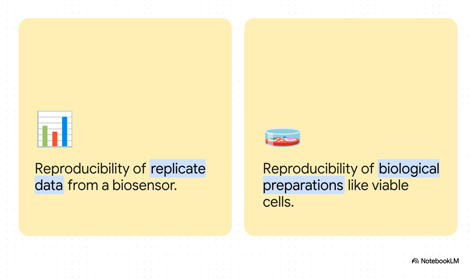You see, reproducibility is actually a two-part test. On one side of the coin, you have data reproducibility, meaning can the device spit out the exact same numerical result from the exact same sample time after time?